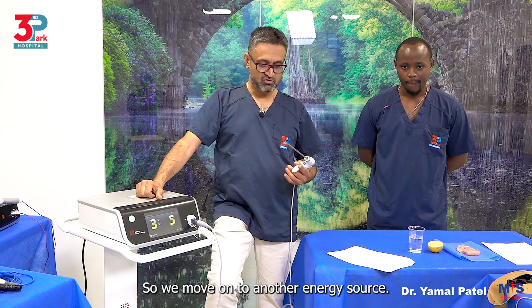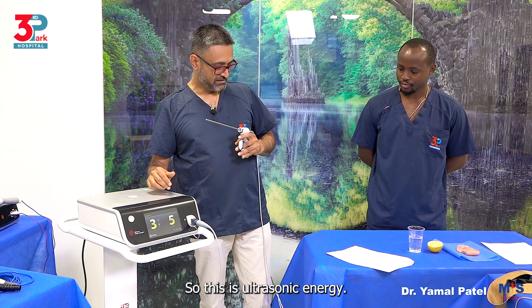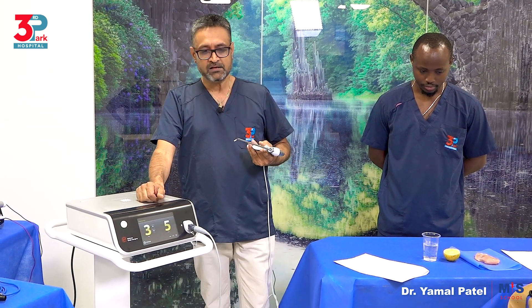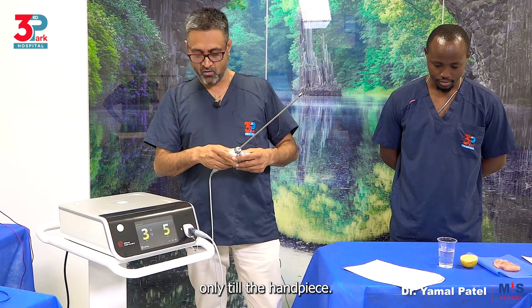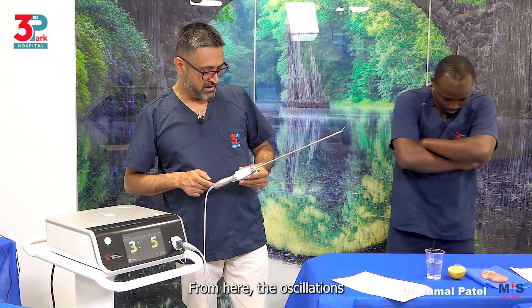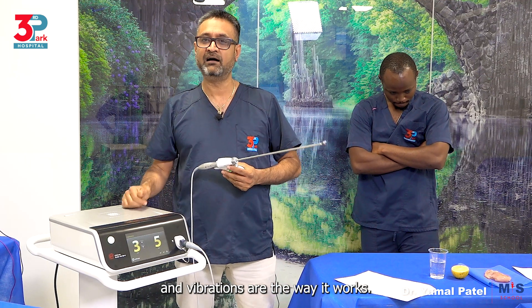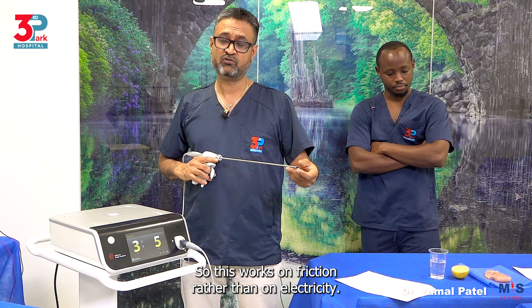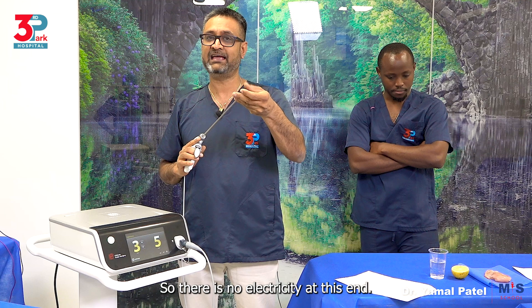So we move on to another energy source. Now this is not electricity. Ultrasonic energy is going to have electricity only till the handpiece. From there, the oscillations and vibrations are the way it works. So this works on friction rather than on electricity — there is no electricity at the working end.